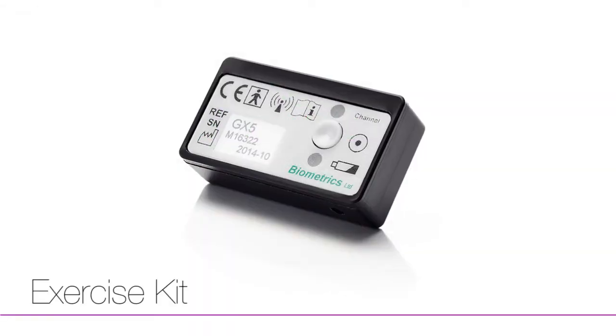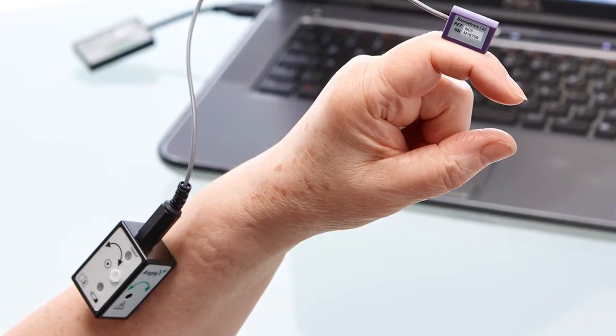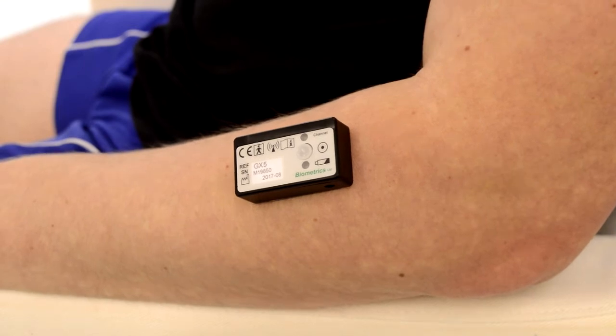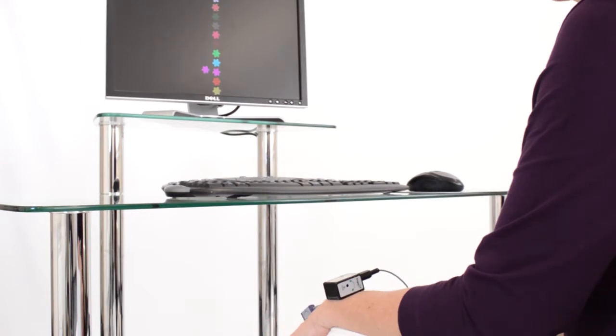The E-Link Exercise Kit includes both MyoX and AngleX sensors that are exclusively designed for innovative computer-based exercise. The Exercise Kit gives immediate biofeedback to the patient and is the ideal tool for undertaking progressive exercise throughout the whole rehabilitation process.